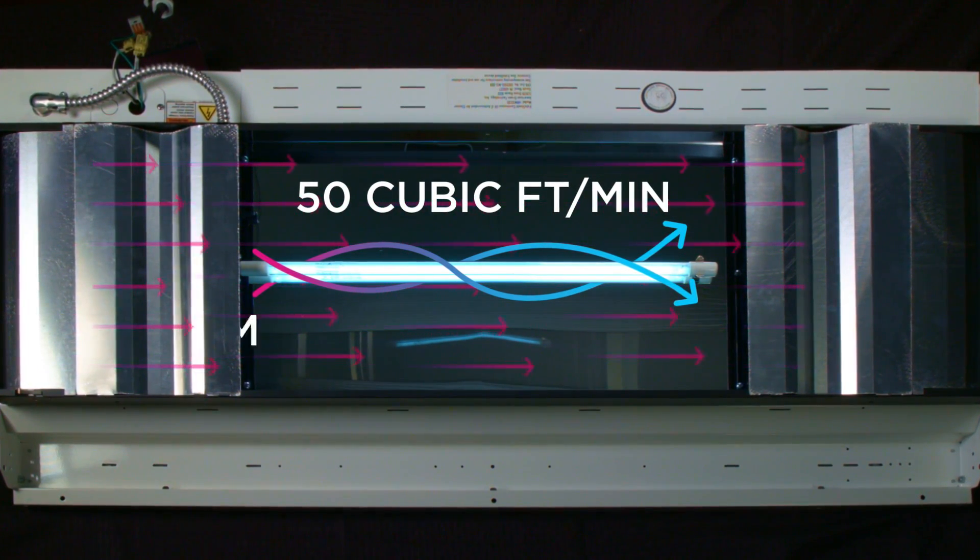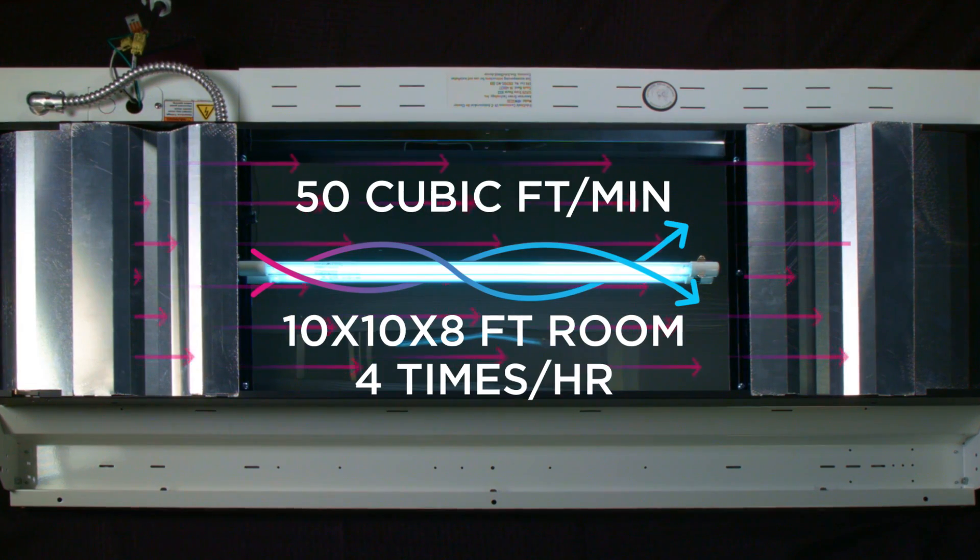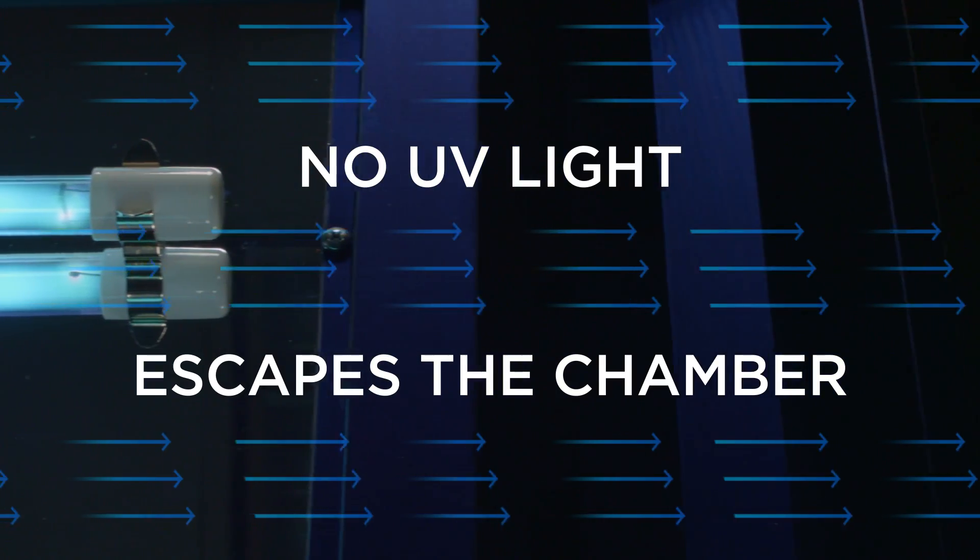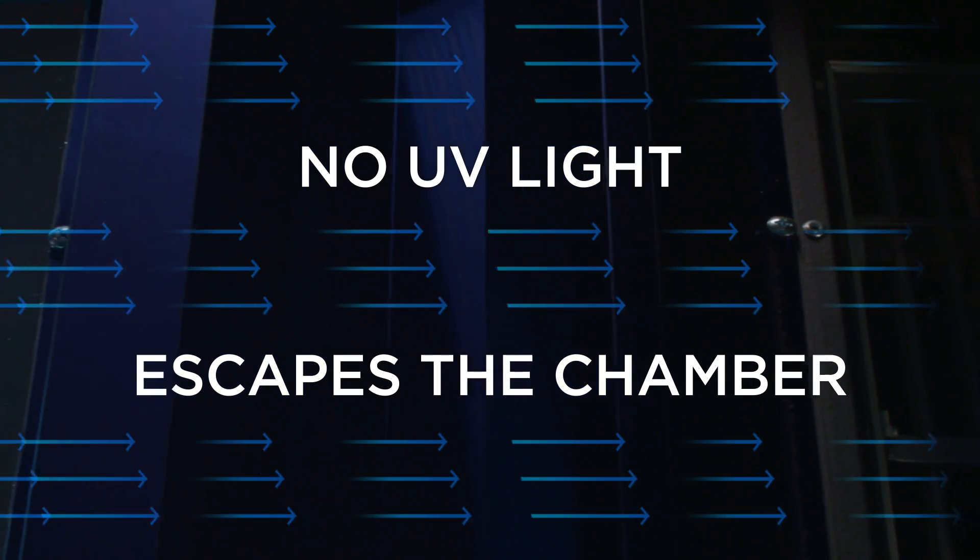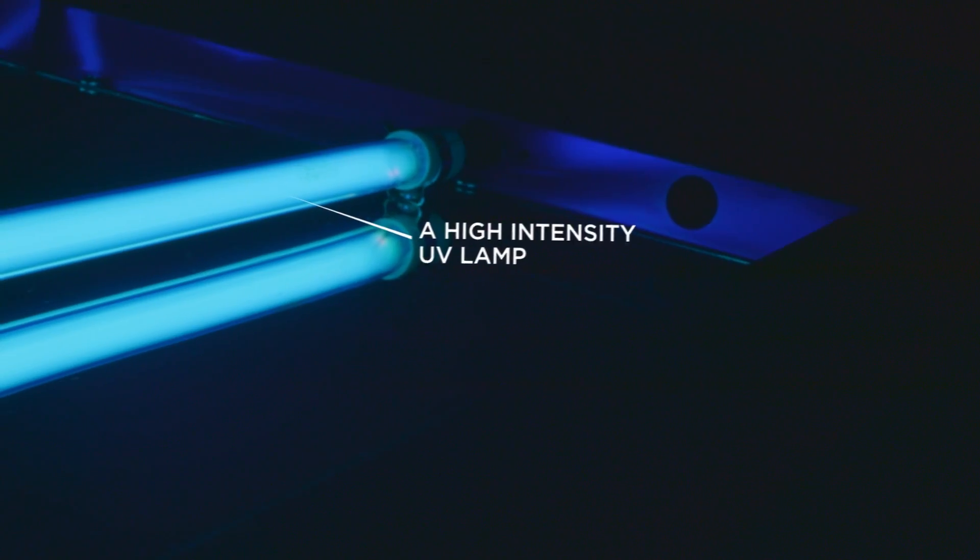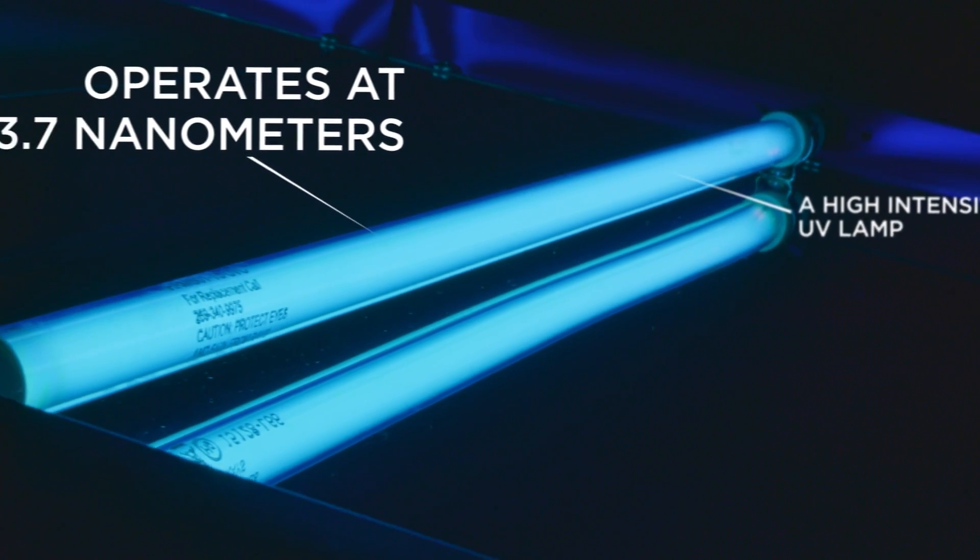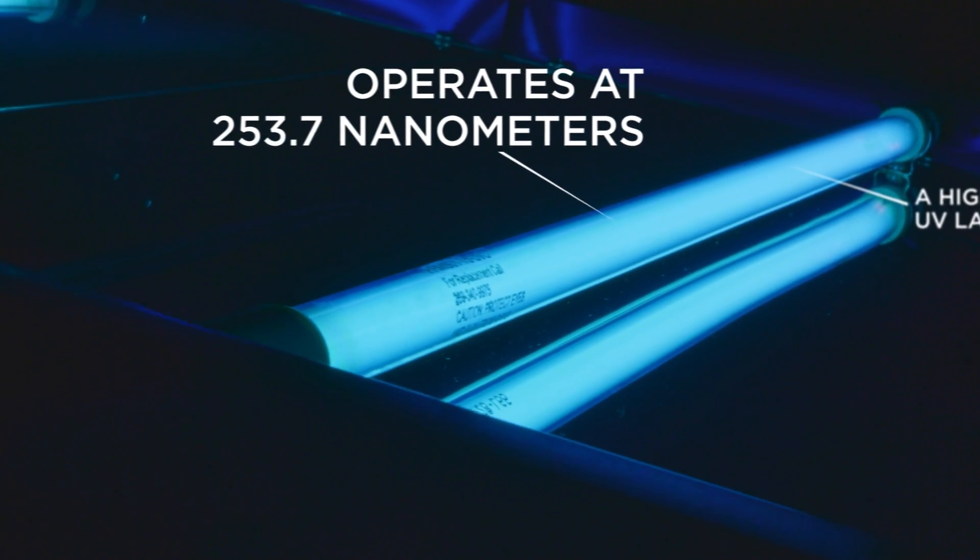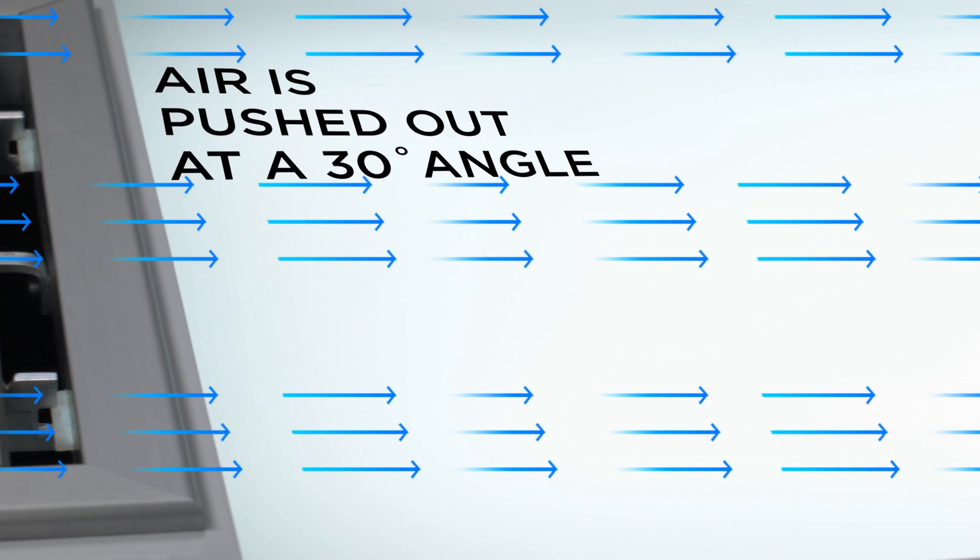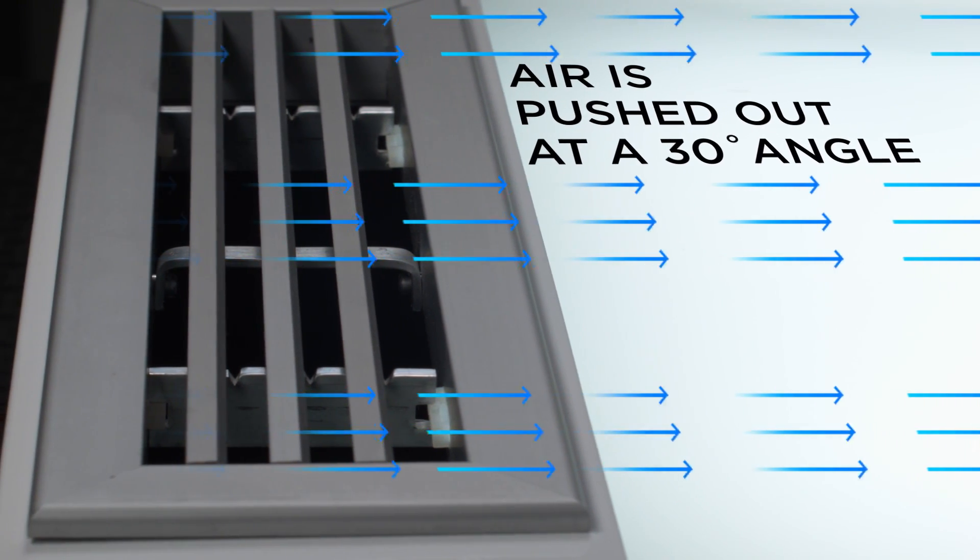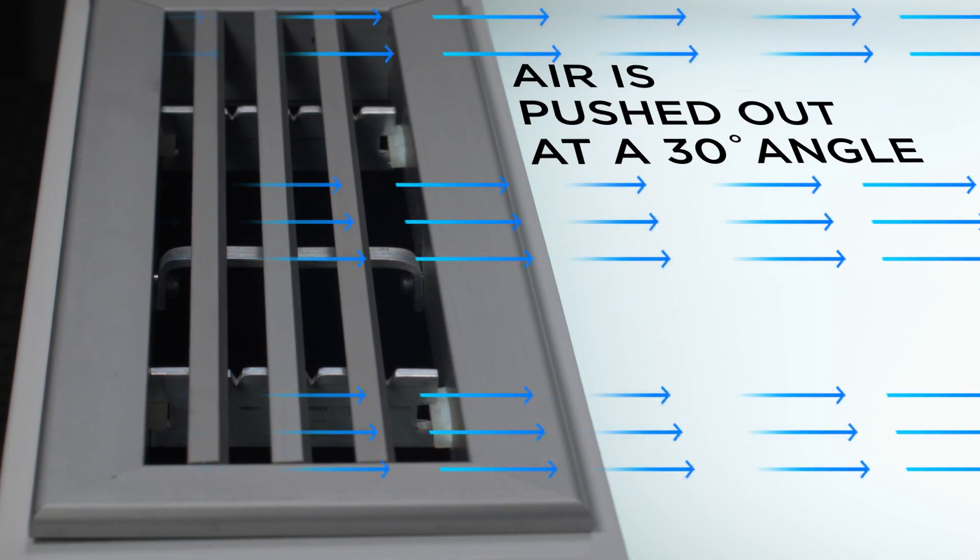It can treat a volume of air equivalent to a 10 by 10 by 8 foot room, four times per hour. The air moves through a set of safety baffles which prevent the UV light from escaping the chamber. Once in the chamber, a high-intensity UV lamp operates at the peak wavelength of 253.7 nanometers. The air is then pushed through an opposing grill at a 30-degree angle to promote circulation of the treated air throughout the room.